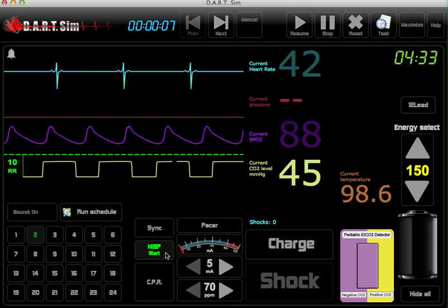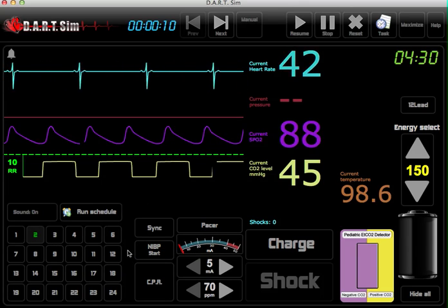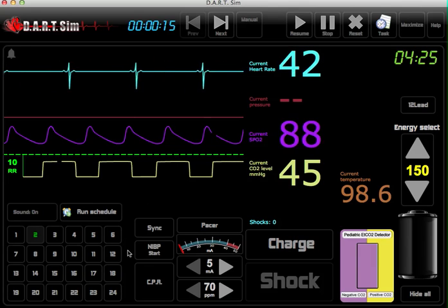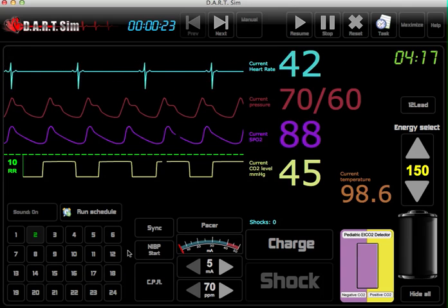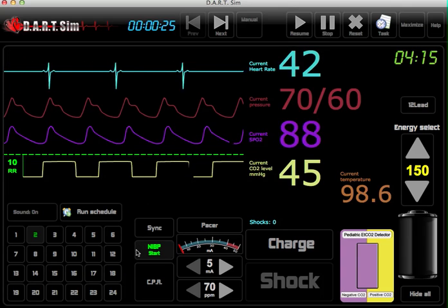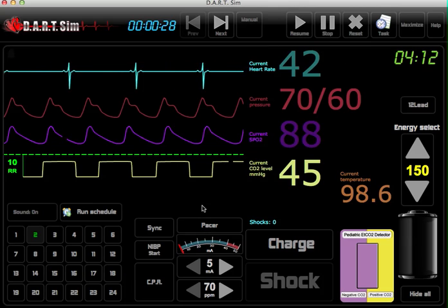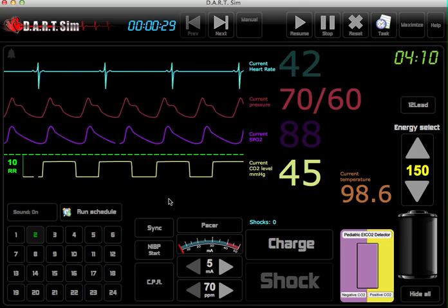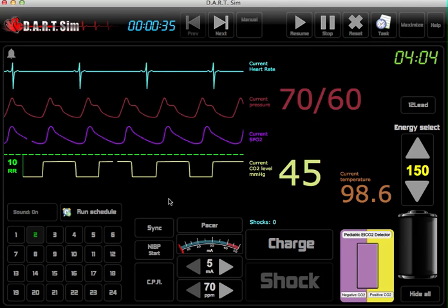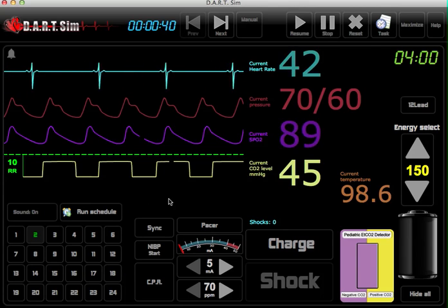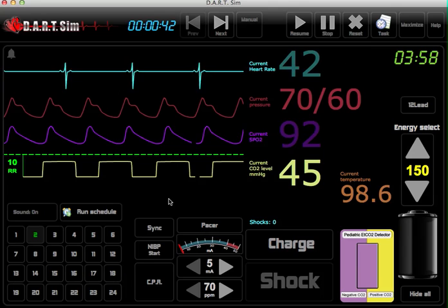You can press the NIBP start button here or hit the N key on your keyboard. And if you want to adjust the SPO2, on your wireless keyboard or standard keyboard — or if it's on your laptop — just hold down the S key and hit the plus or minus, however well your student performs.